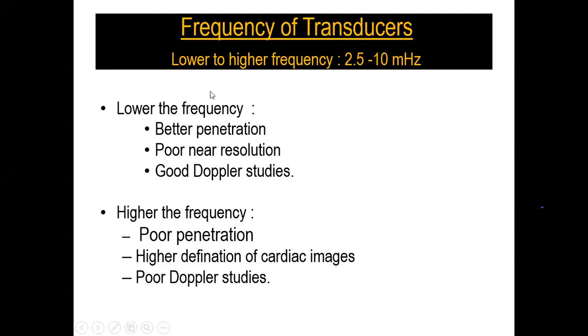So in adults we use lower frequency, but in pediatric or neonatal we use higher frequencies. But the problem lies with both. With adult, we do not have a good near resolution. On the other hand, with a high frequency transducer, we do not have good Doppler studies. So these are two lacunas which we encounter with these kinds of transducers.